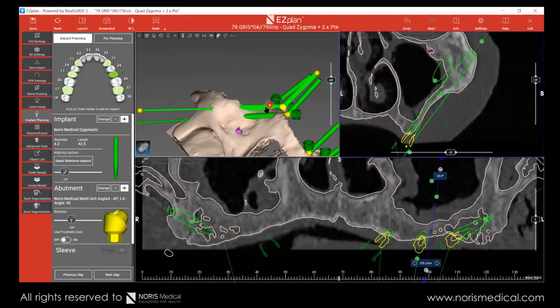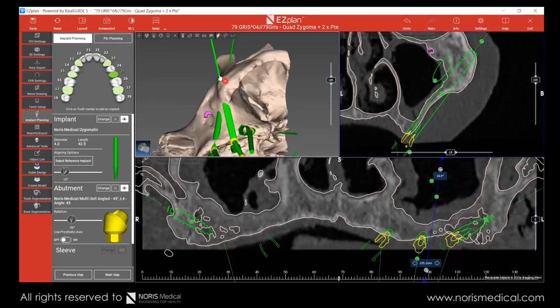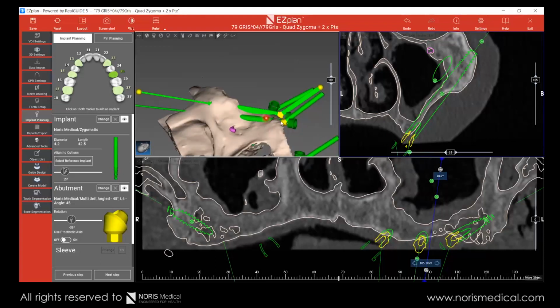Now, what I've shown here is just for understanding the parallel. Of course, as I explained before, we do that with a diamond. We guess a point, we start going with a diamond, first of all, on this line. We put a point here, we mark this line, and we start removing bone material from the crest. And all the time, we have to look and see that when we are parallel, we still have this distance here. I'm repeating myself because it is so important.